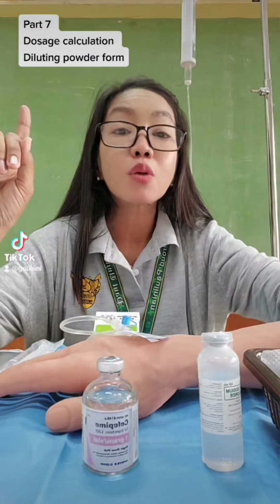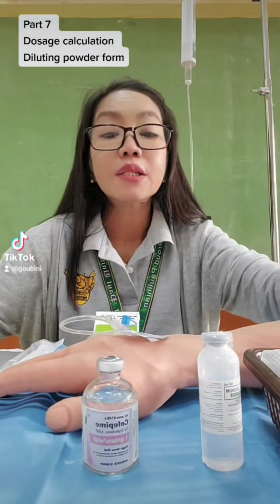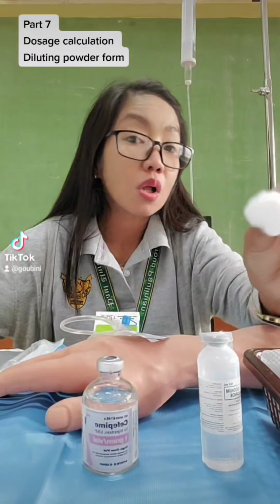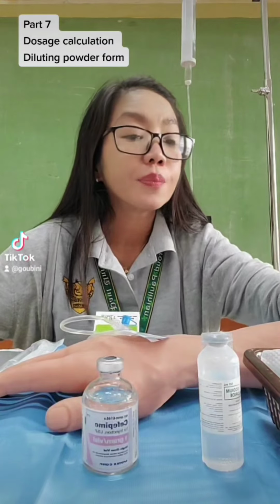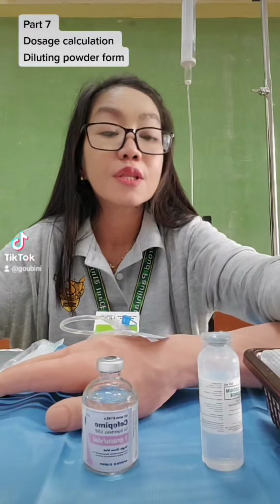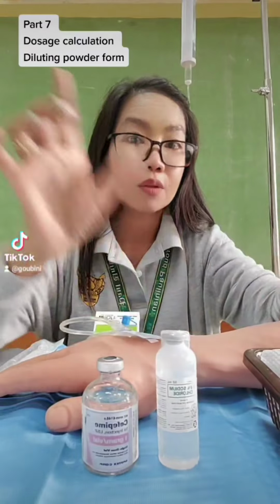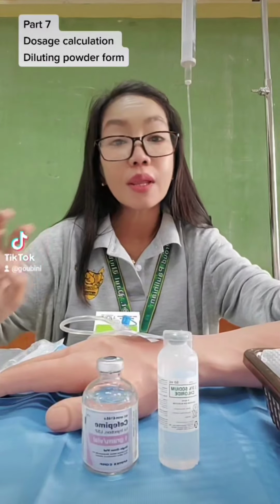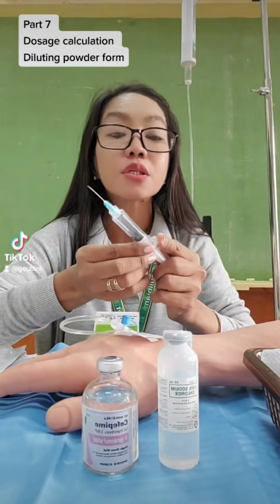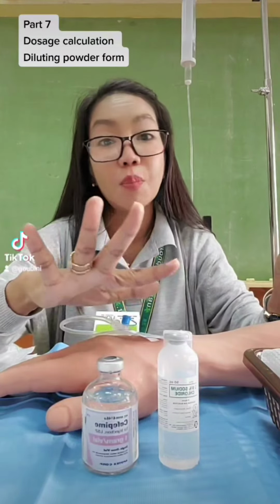Begin with disinfecting: removing the lid of your vial, and then disinfecting it with cotton balls with alcohol or an alcohol swab. Discard it in the kidney basin, and then you will also have to remove the covering of your NSS and disinfect it with alcohol. Then you will need your syringe. This is a single-use syringe and single-use NSS, meaning it's your patient's stock.